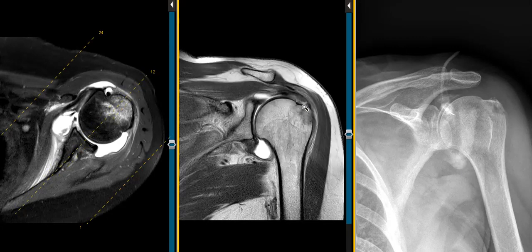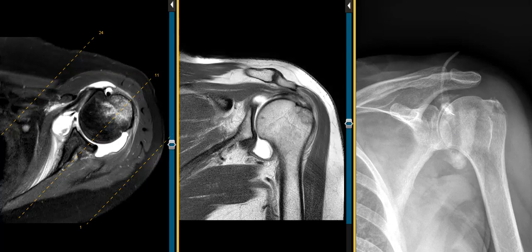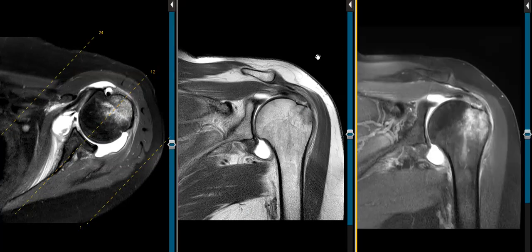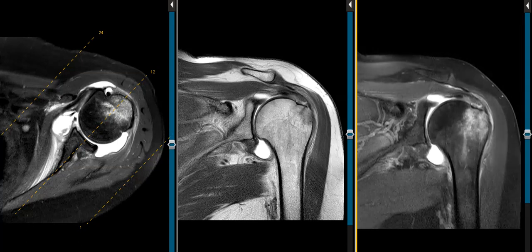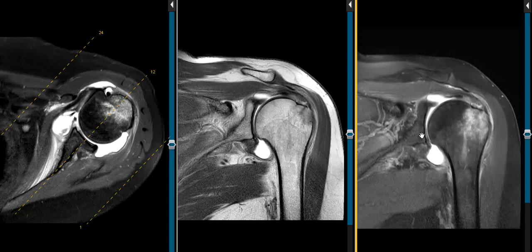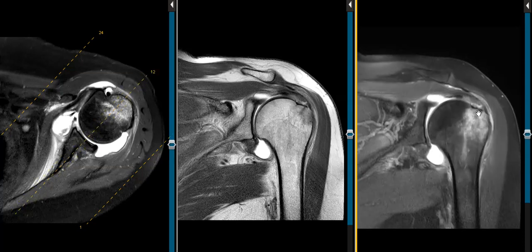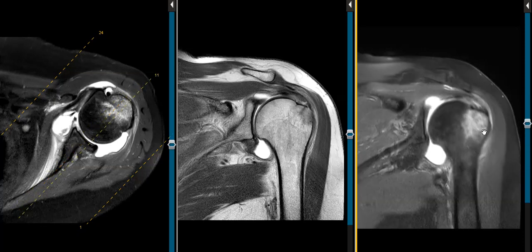Now these are images from the MRI done after the arthrogram, and we see the fractures over here. It does not show up as well on MRI as it does on x-ray, but we do see brightness out here — this is marrow edema associated with this fracture. This is a fat-suppressed proton density sequence. We see contrast in the joint filled here, and marrow edema in the greater tuberosity. We don't see the fracture lines as well, but we know there has been an injury here with a non-displaced fracture.